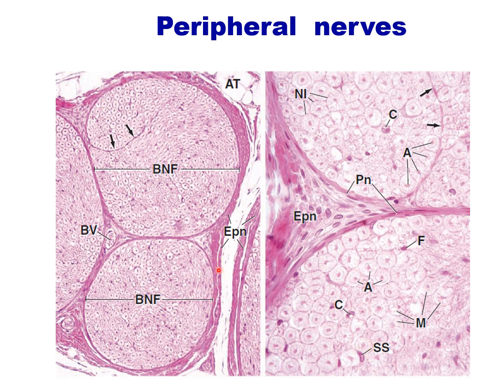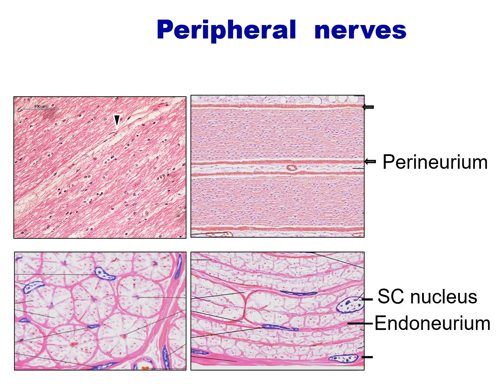So this is the connective tissue, this is called the epineurium, and this connective tissue going inside the nerve fiber is called the perineurium, which carries the blood vessels for supplying the axons and the other materials inside the nerve fiber. This is the longitudinal section of the peripheral nerve showing the perineurium. This is in the lower power. The perineurium is present here.